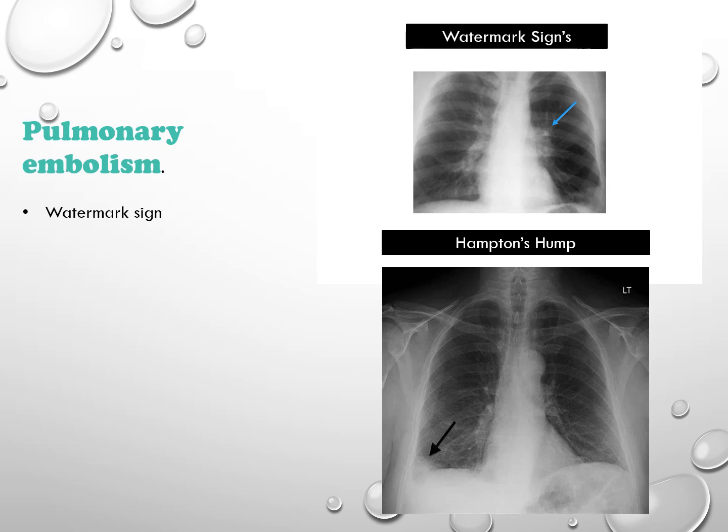These x-rays reveal signs suggestive of pulmonary embolism. The Westermark sign, visible in the first x-ray, displays the dilatation of pulmonary vessels proximal to the embolism, alongside the collapse of distal vessels. Additionally, the presence of a Hampton's hump in the second x-ray, characterized by a cone-shaped area of peripheral opacification, typically signifies infarction.